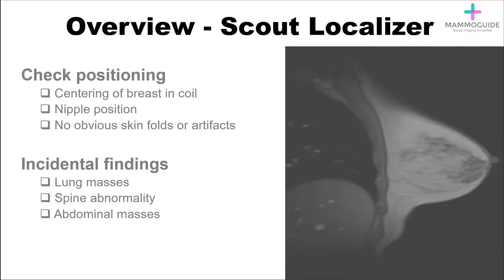The scout localizer sequence warrants a quick review. On this sequence, which is primarily used to aid the technologist in positioning the patient, you also want to check the positioning. Make sure that the breast is centered within the coil, make sure that the nipple is positioned in the center, and that there are no obvious skin folds or artifacts. Also, take a quick glance at the surrounding structures to make sure that there's not any incidental findings.